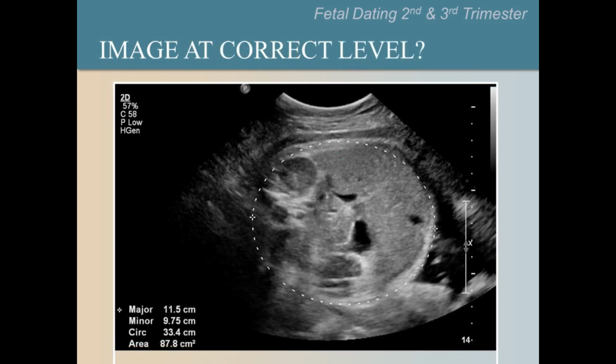Please ask another participant to identify the umbilical vein, stomach, and spine. Then please answer the questions. Is the ellipse position correct? And is the abdomen round? Please pause the video now to discuss.